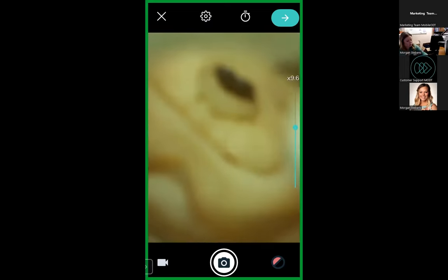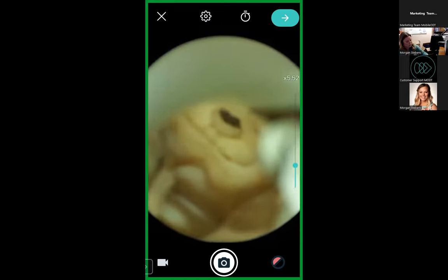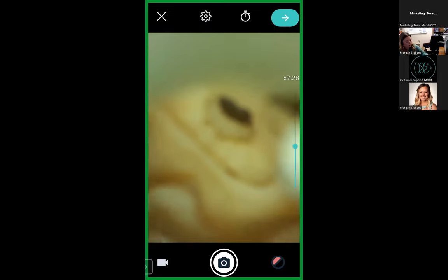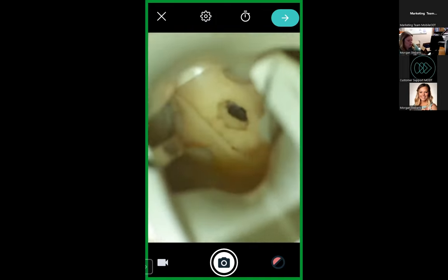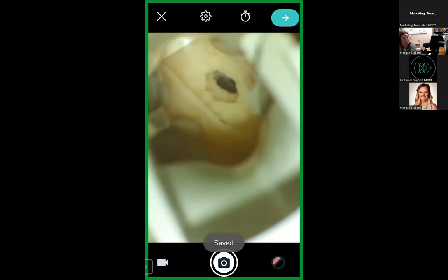So now I'm going to zoom in a little bit and just tap my screen to have it. Okay, sometimes I go too fast. So that's not the picture that I want. So I'm going to move my stand out. Oh yeah, there we go. That's much better. But my camera is, there we go, gotta tighten it. There, that's the picture that I want. So I'm just going to take a photo. And you can see when I touched the screen, it moved a little bit. So that is what it looks like to use it.